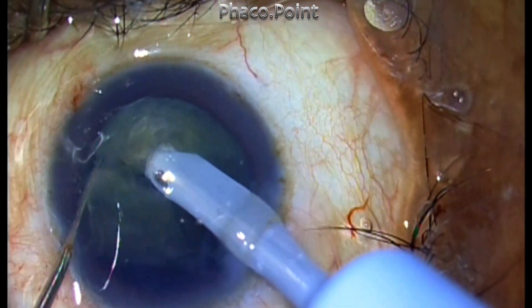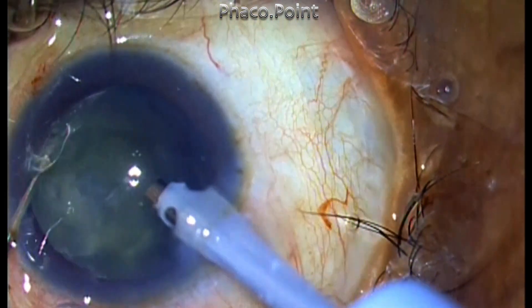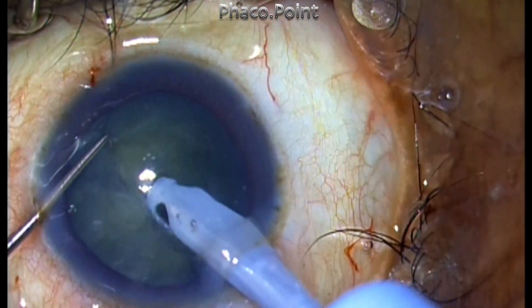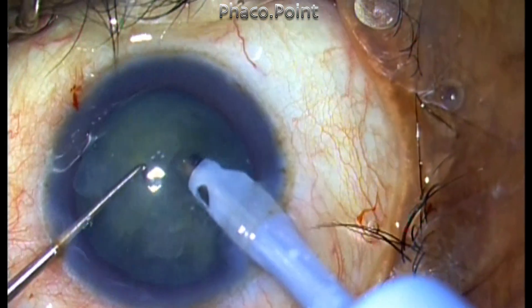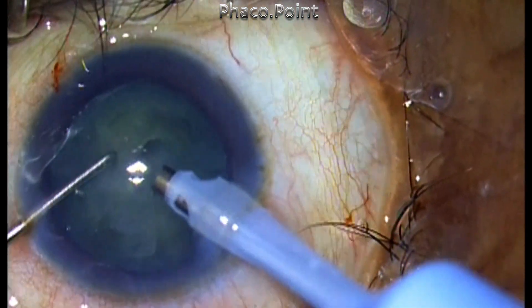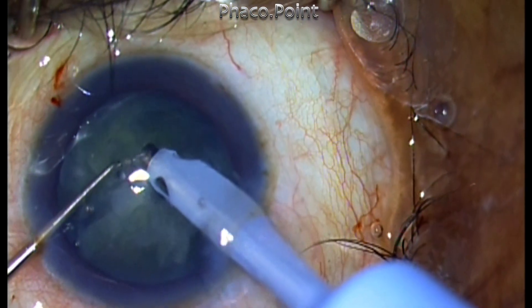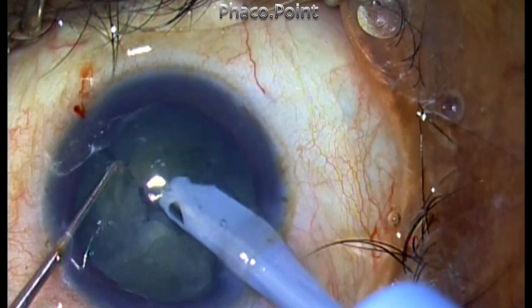The other problem is that you need to create smaller fragment sizes, because creating four large fragments may make it difficult to mobilize them through the small capsulorhexis opening. The capsulorhexis puts a lid on the nucleus, making it very difficult to move fragments into the central space.